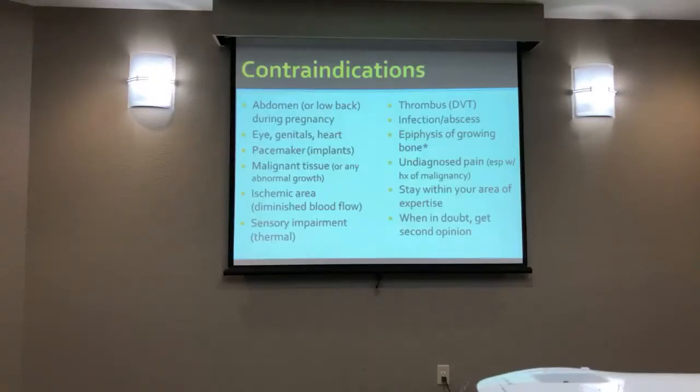But could it heal tissue? That's a good question, especially with the diabetic population, given the research, mostly done by the company that makes MIST. Some of their evidence is kind of compelling, especially with the diabetic population, where they weren't going through the phases of healing, and they were able to stimulate it. It's so hard to prove why, if it's the enzymes, the cell activity, the vibration, but in most cases you can see the benefits.